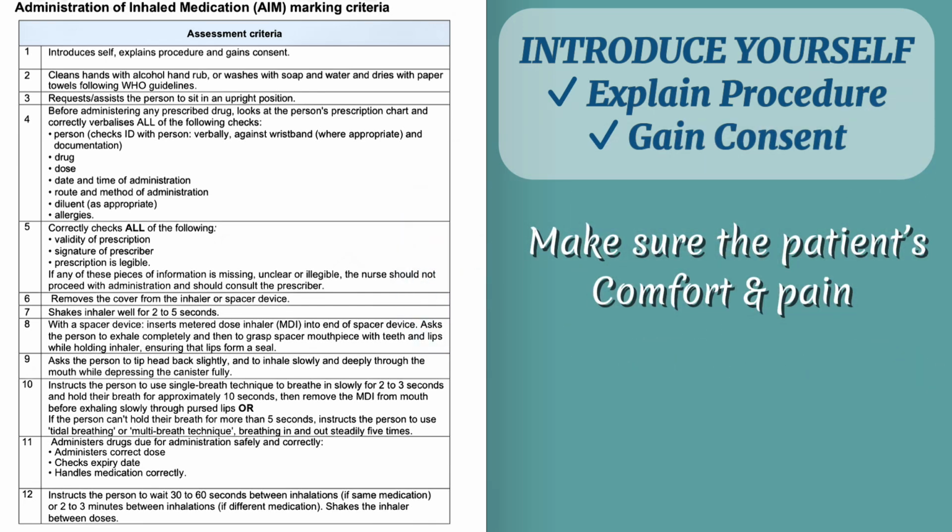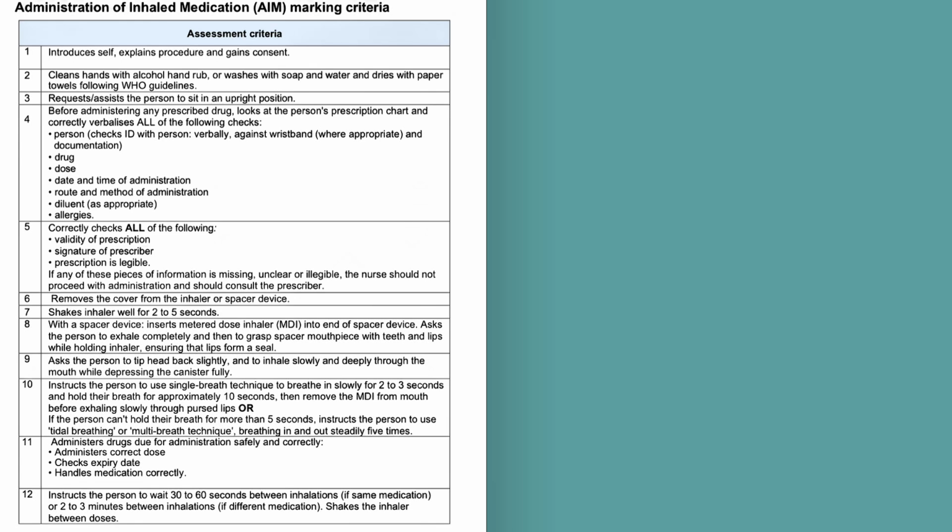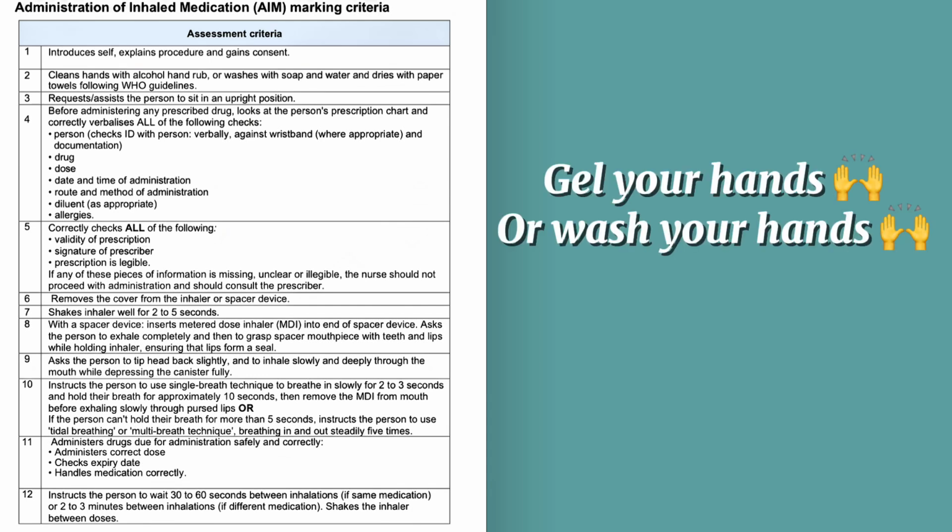Have you got any pain at all? Can you please rate your pain 0 to 10, 0 being no pain, 10 being worst pain? Alright, I'm just going to gather all the articles. I will be back in a minute. Thank you. Gel your hands. Let it dry for 30 seconds.